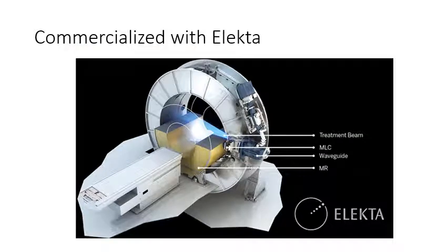The University of Utrecht approach has been commercialized by Elekta, which is one of the major linear accelerator manufacturers. This diagram, provided by Elekta, shows the linear accelerator placement on a larger gantry surrounding the MRI bore.